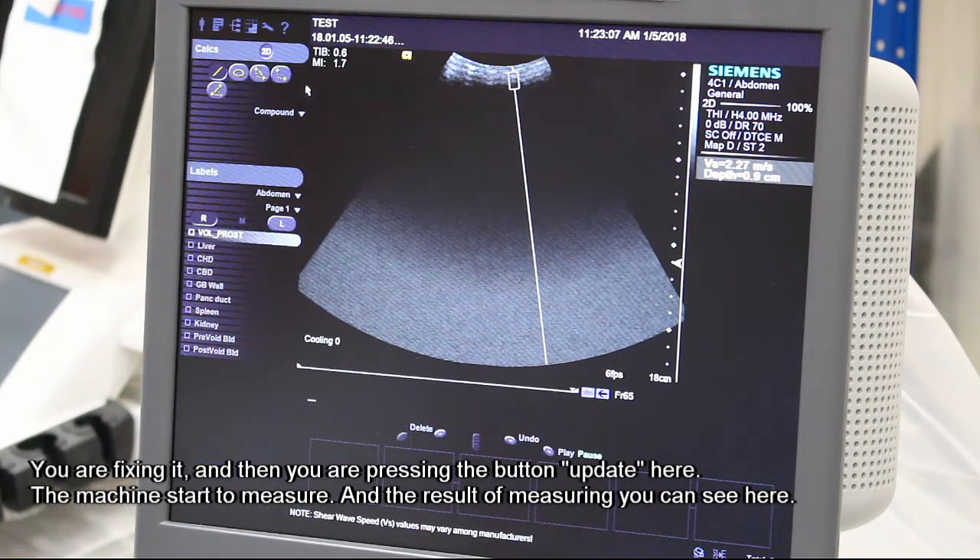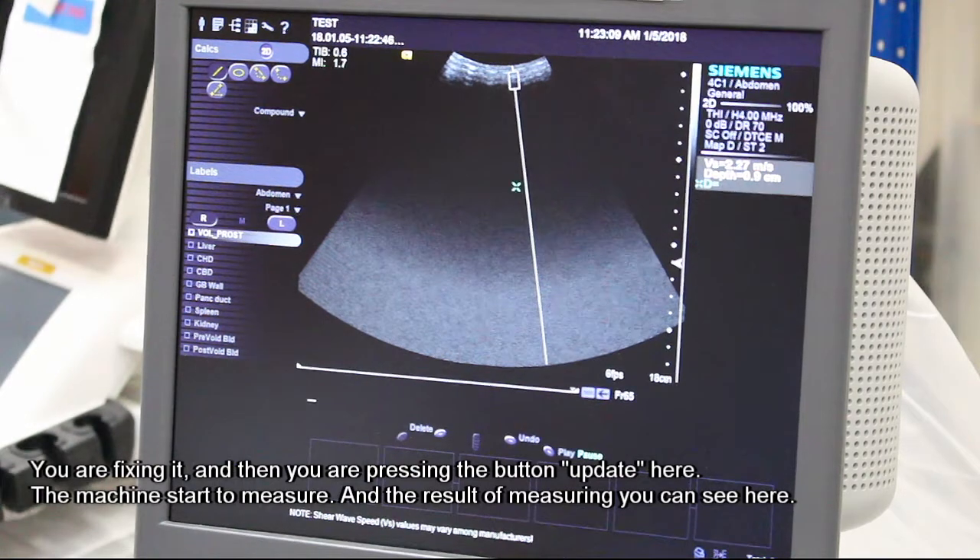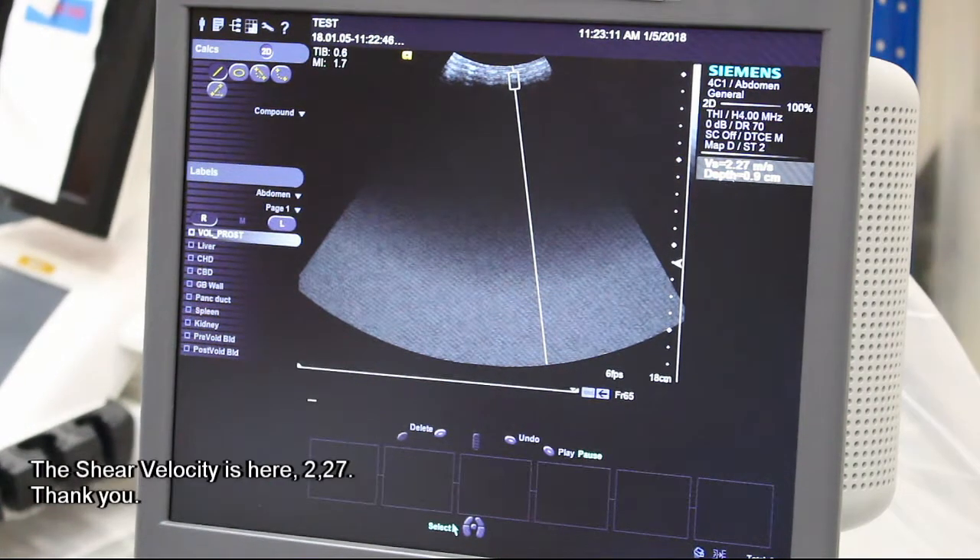The machine starts to measure, and then the result of measuring you can see here. The shear velocity is here 2.27. Thank you.